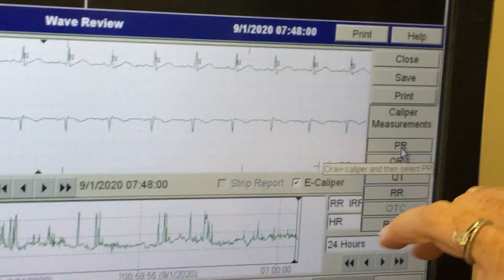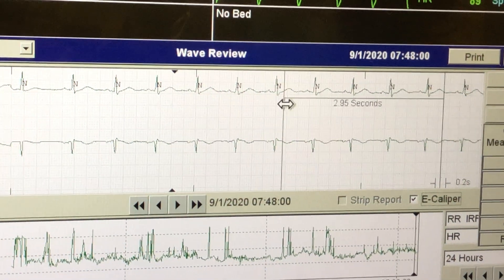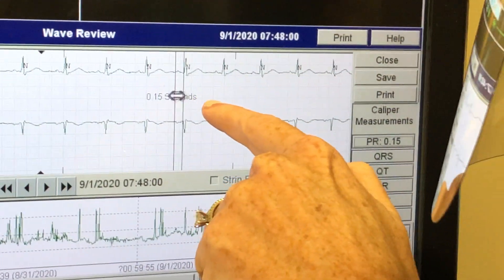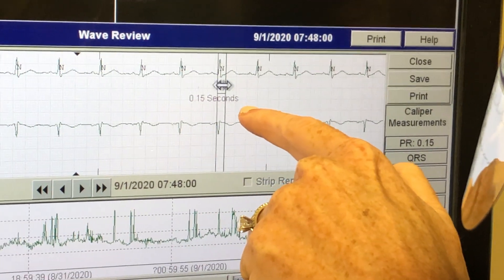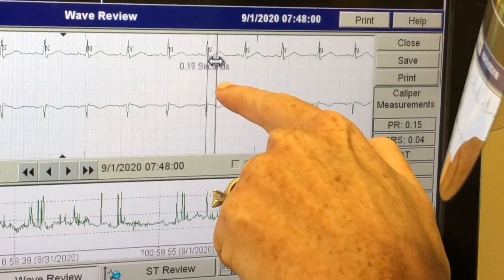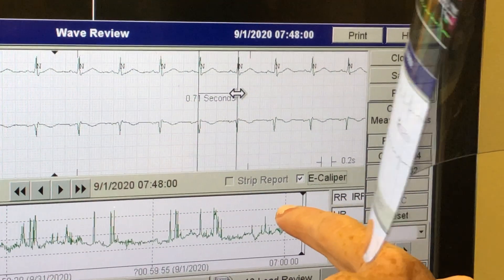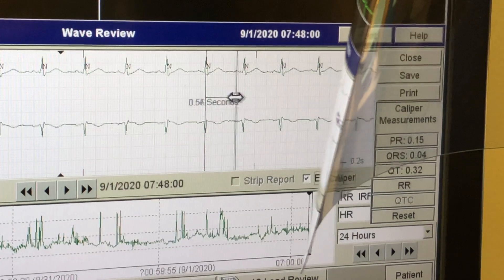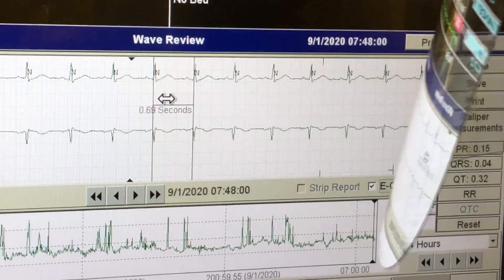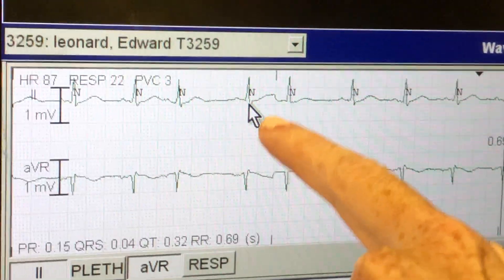When you use the e-calipers, click here. You have to click on this before you measure. Then get your PR interval — click on it — then QRS, just drag it, and then QT. Everything looks fine. For R-to-R you can check if it's sinus rhythm — drag it — so it's just like regular calipers. This looks regular.